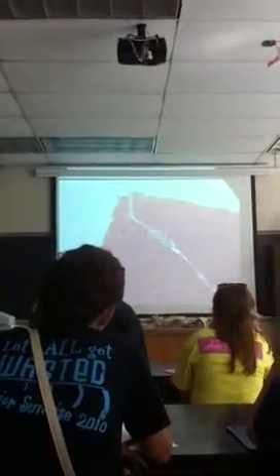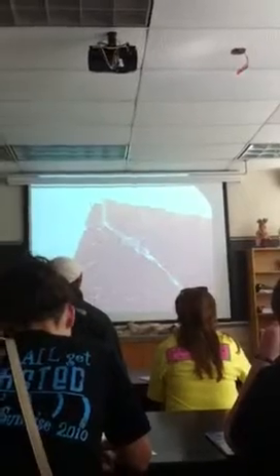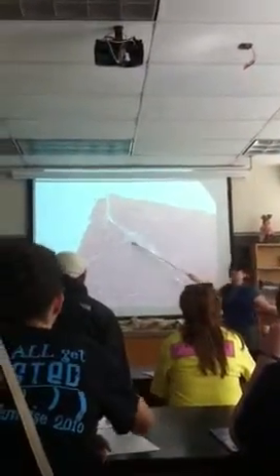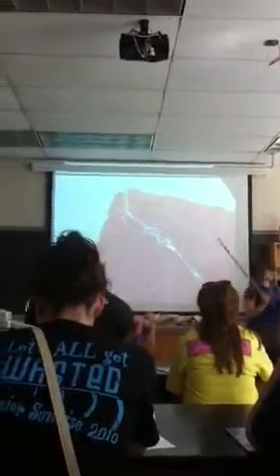Nicer on the stain. It's a little darker. And right here will be portal triad. So when you're looking at a distance, a lower magnification on a portal triad, you're going to see sort of this clearer area around it, where it's a little bit lighter in color. So that's kind of a good standout there.